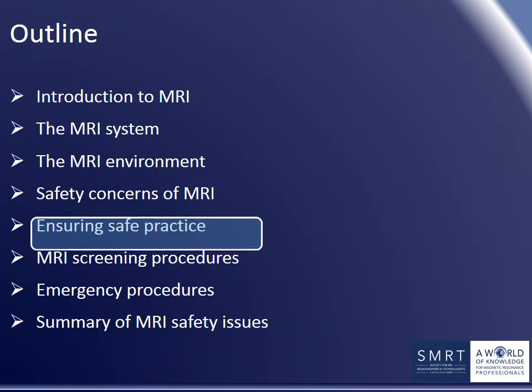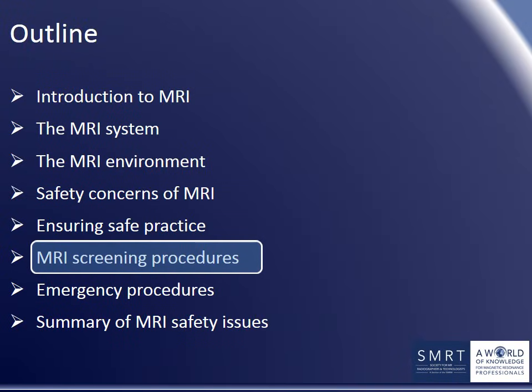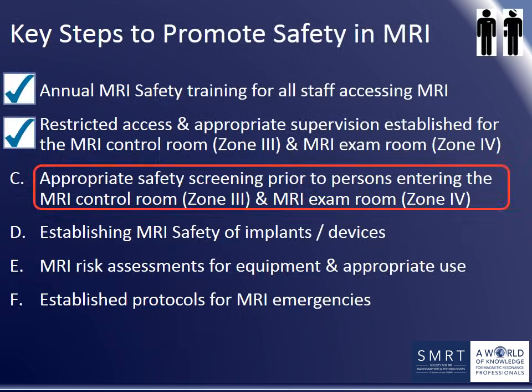Next, we'll discuss MRI screening procedures. The third key step for promoting safety in MRI is appropriate screening of persons before they enter the control room and MRI scanner room.